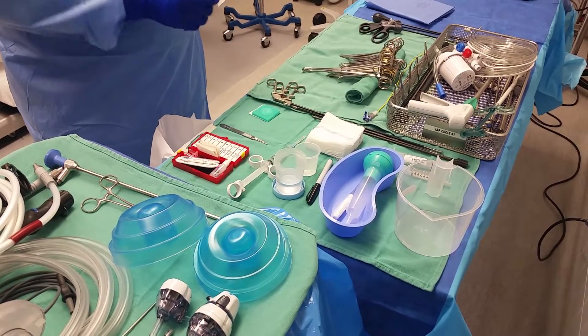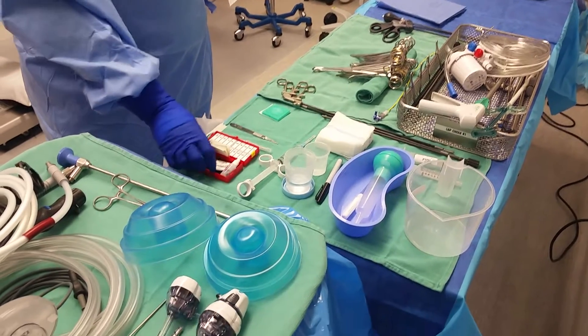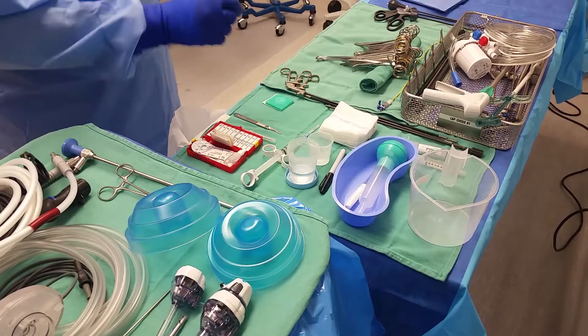This doctor particularly likes to use an angiocatheter for the cholangiogram — I have that covered. And my closing suture is right here, extra credit if you need it.